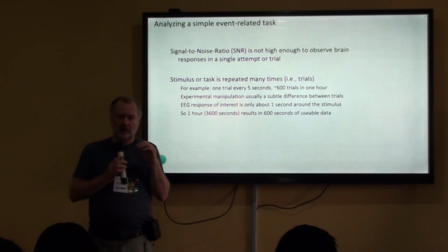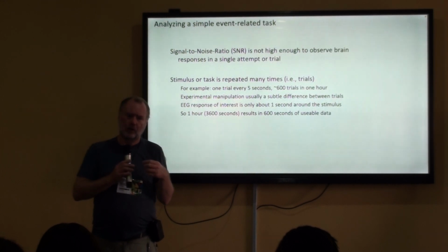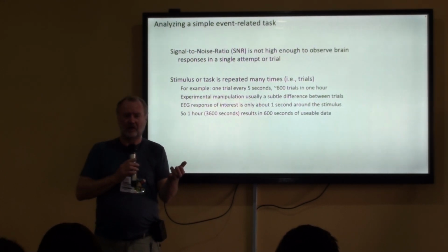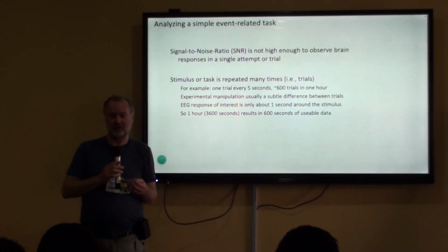I would also say, if you design an experiment, don't make it too short. Because if you're going to spend half an hour preparing the participant, and you're only going to record 100 trials, then the participant is done in 10 minutes. Which means that you actually have a very low return on investment, because you spend a lot of time preparing the participant, and you're actually getting little data. So if your participant's there anyway, just make use of the participant.